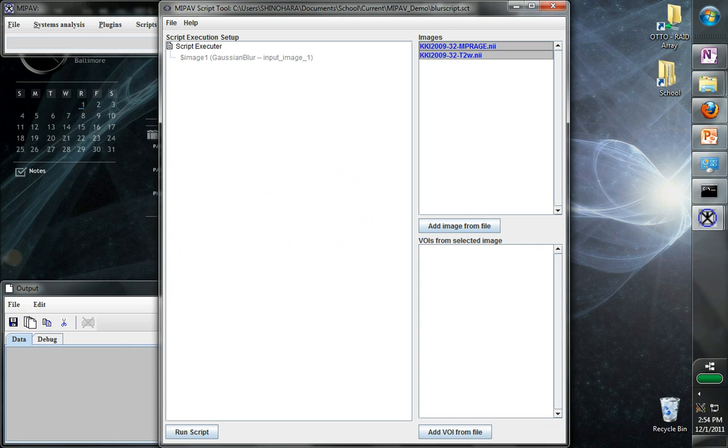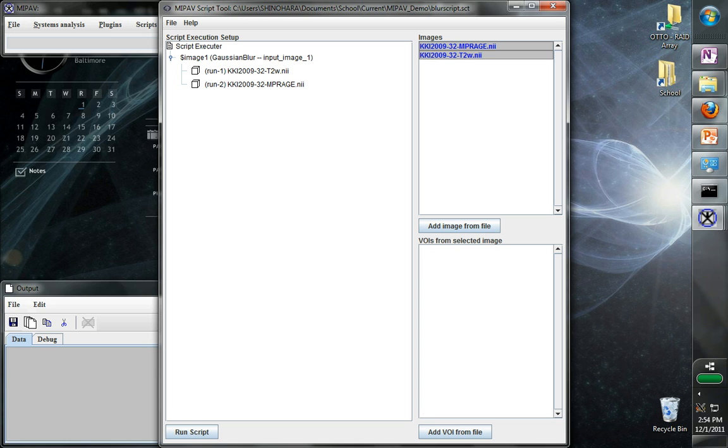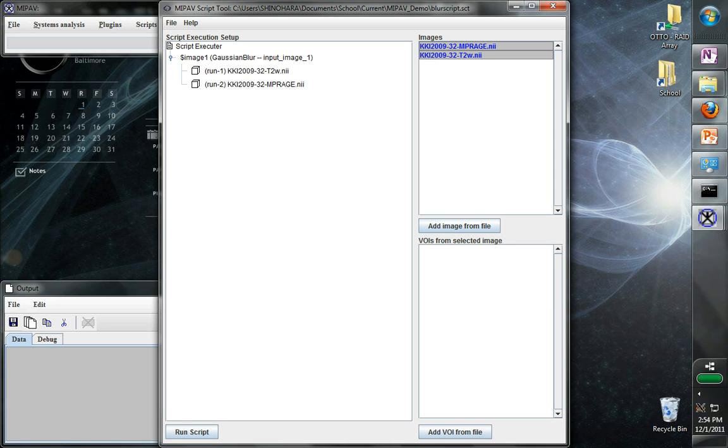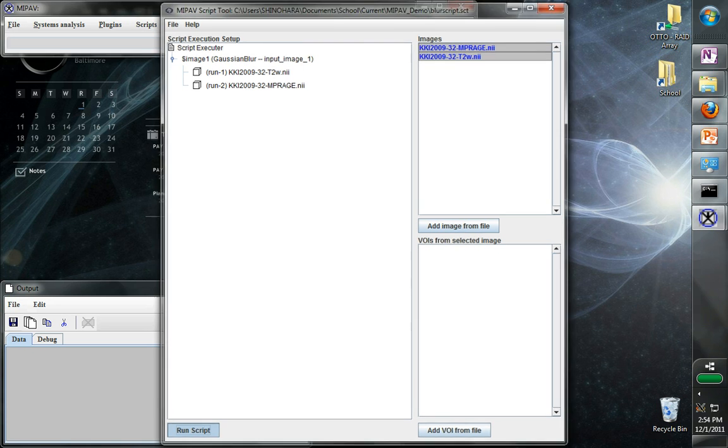If we want to apply the script to these images, we can drag them over here to the input 1. Now it tells us that MiPav is going to run the first time on the T2, and then the second time on the T1. This is actually going to go through and apply the procedures that we taught it to each of these images. So we can go down here and click run the script.